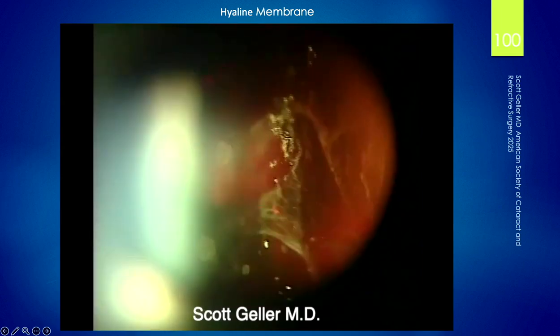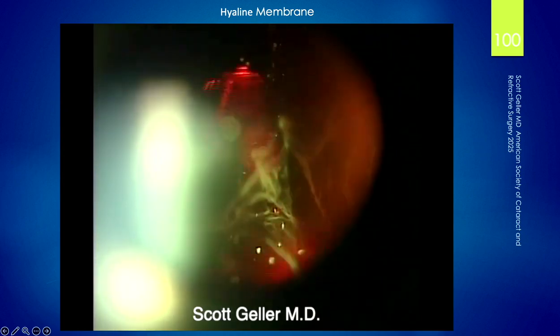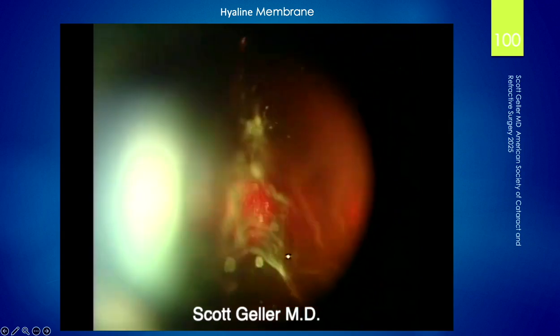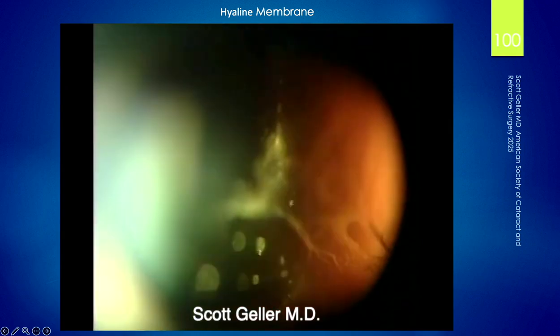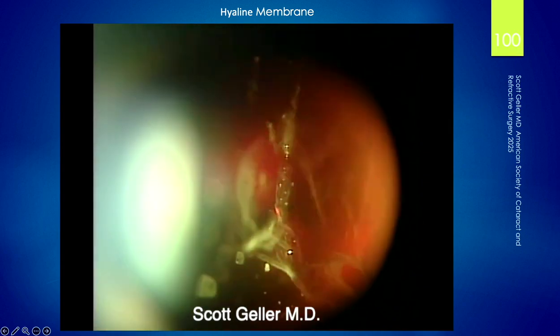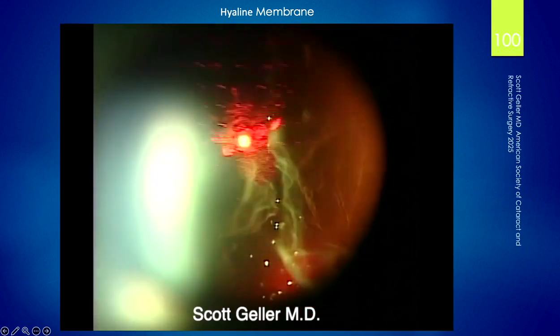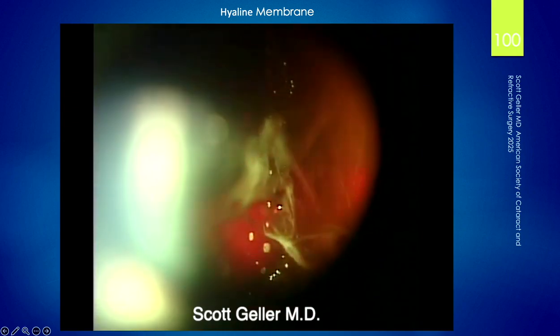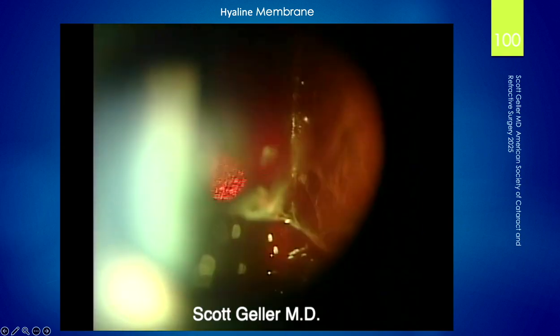I explained to him what we were trying to do was we're not going to remove or vaporize this. What we're doing is opening it. And these two edges of the hyaloid will retract medially and laterally. He will have a clear visual axis in the center and will be a happy patient. A lot of doctors would do a vitrectomy. There was a reason he didn't want a vitrectomy. I forget exactly what it was, but it was a legitimate reason.